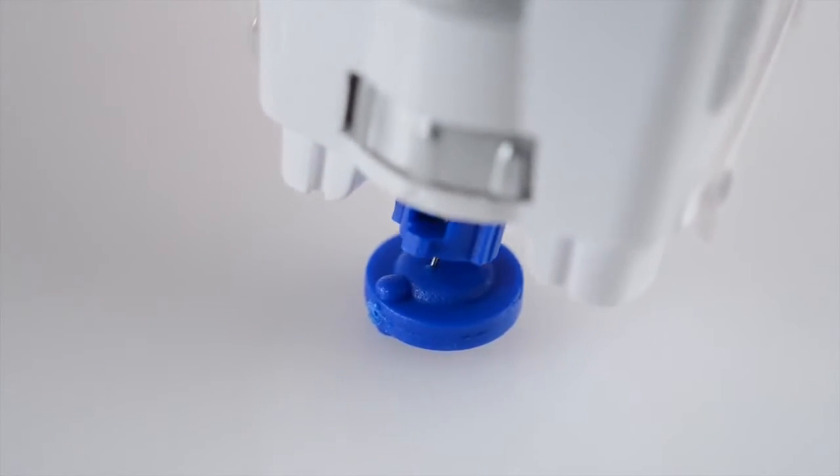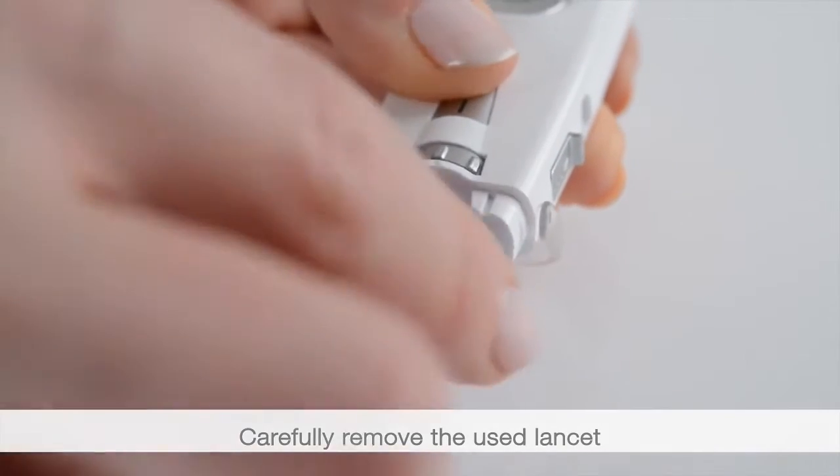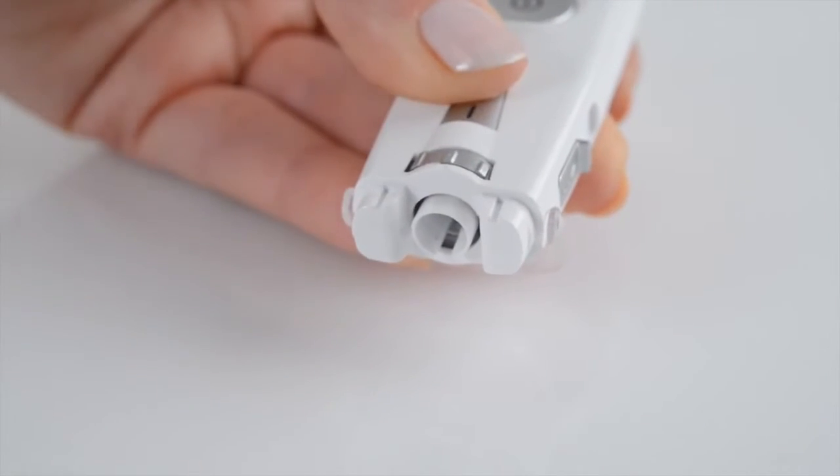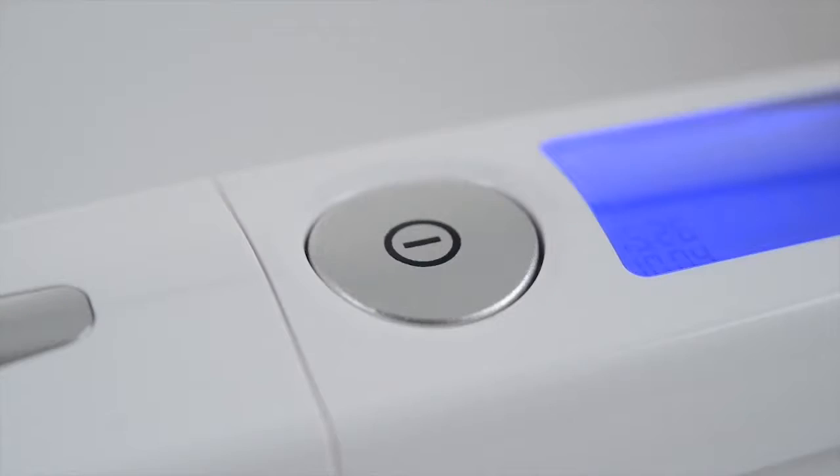Remove the cap from the lancing device. Use the tip of the needle to carefully prick the protective disc that has been removed. Press the trigger and simultaneously pull on the tensioning device. Place the protective cap back onto the lancing device. Switch off the device.